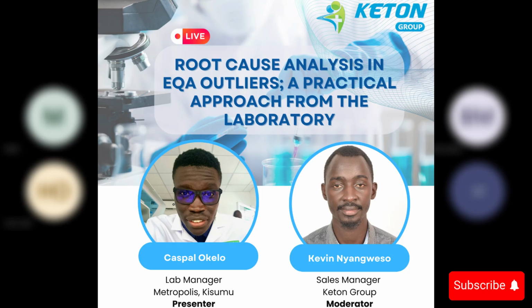So after that, you need to stop checking if my QC is just within plus or minus 2 SD. When you are reviewing your LJ charts properly, you look at rules like the 7T, which is 7 points on one side, 10x rule. So these gradual upward or downward shifts in things like platelets, where the QC is still falling within range, but there might be a calibration shift.